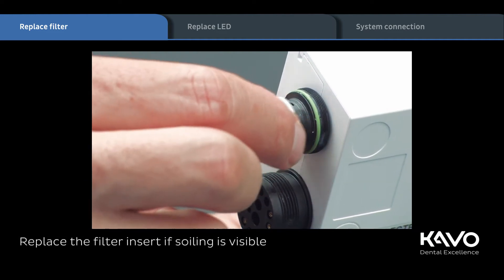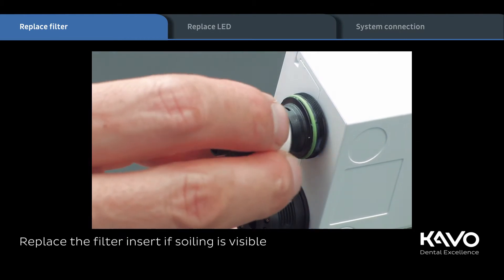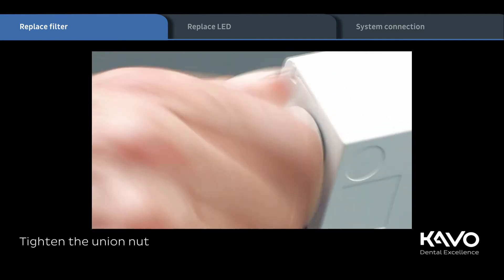Replace the filter insert if soiling is visible. After that, tighten the union nut and check for filter leakage.